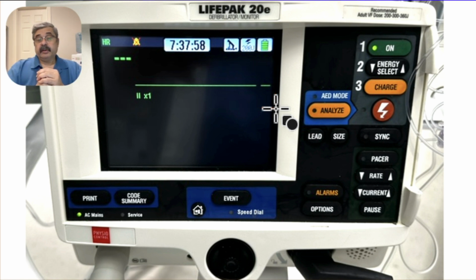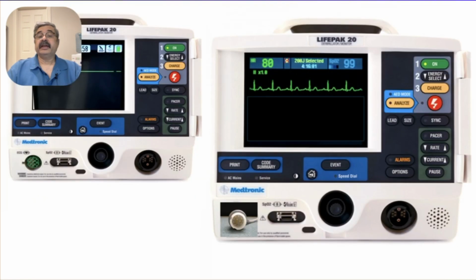However, what can possibly happen is that if you do not attach the EKG synchronization cable or get the EKG directly from the patient onto the monitor, this is what it could look like even when the patient is in the room and is being monitored.